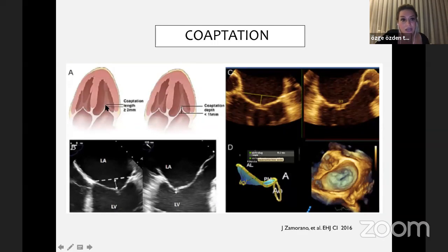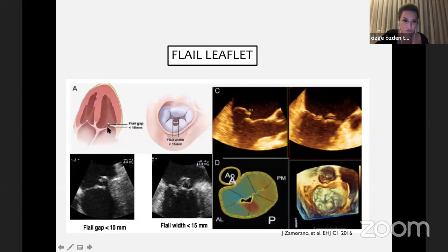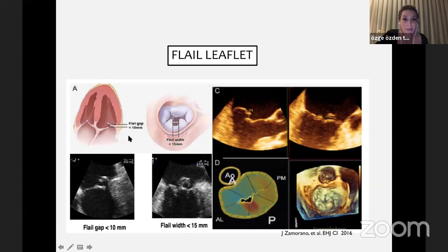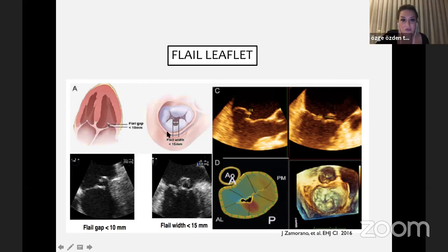Regarding coaptation, coaptation length — where the leaflets are touching each other — must be at least 2 millimeters, and coaptation depth must be less than 11 millimeters. For flail mitral leaflets, the flail gap must be less than 10 millimeters and the flail width in the en face view must be less than 15 millimeters. We must also be aware that after the first clip the mitral valve area is reduced by about 25–50%, and after the second clip again around 20–30%, so we must predict what will happen during and after the procedure.